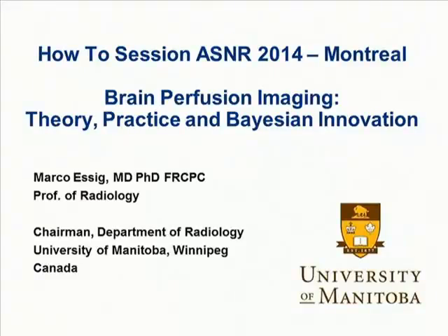The topic is about perfusion imaging, and we have heard in previous talks during the week that neuroradiology is a very exciting area. We do see a lot of functional imaging techniques that need, of course, a proper acquisition as well as very important good post-processing. And this how-to session over lunchtime is a session where we address that both in CT and MRI.